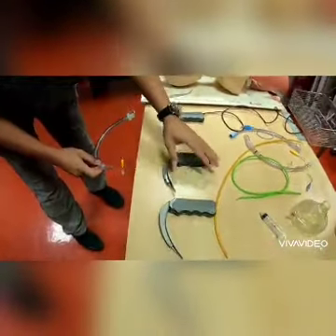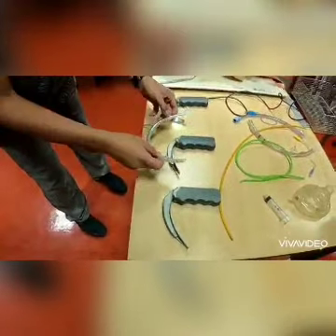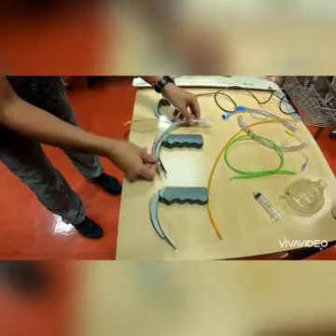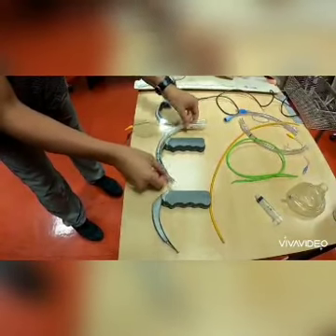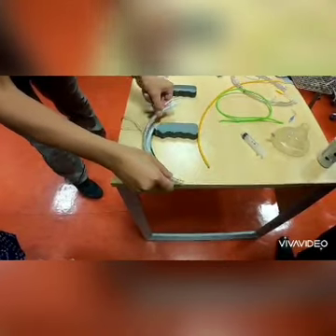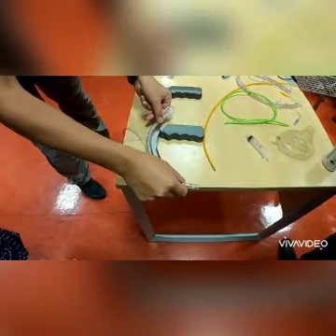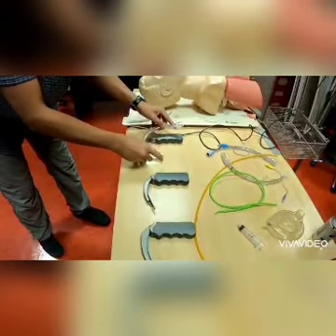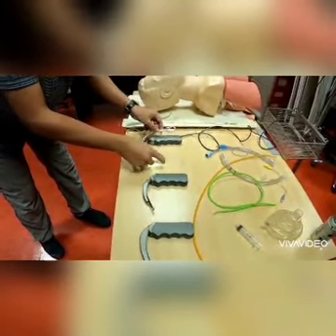Clearly, if you are using a size 3 blade, this is not the right shape. You'll need to make it this shape. And if you're using a size 4, it's very similar to a size 3 CMAC blade. So for this demonstration, I'm going to use a D blade, as you can see.